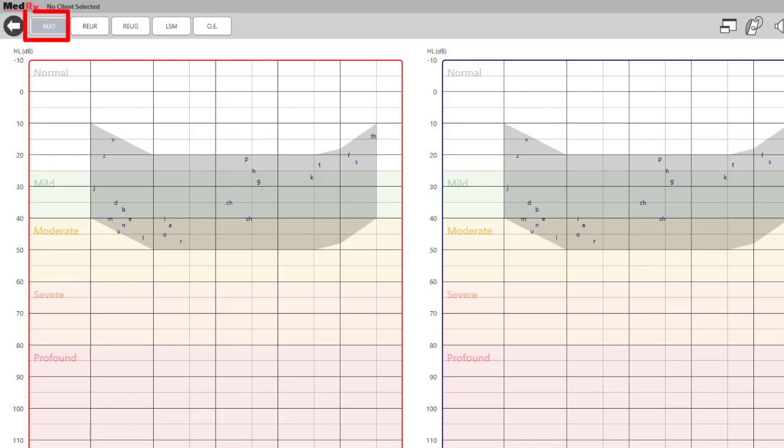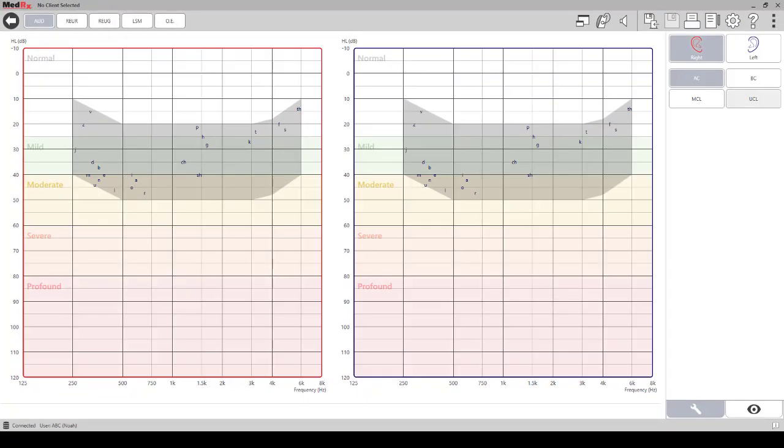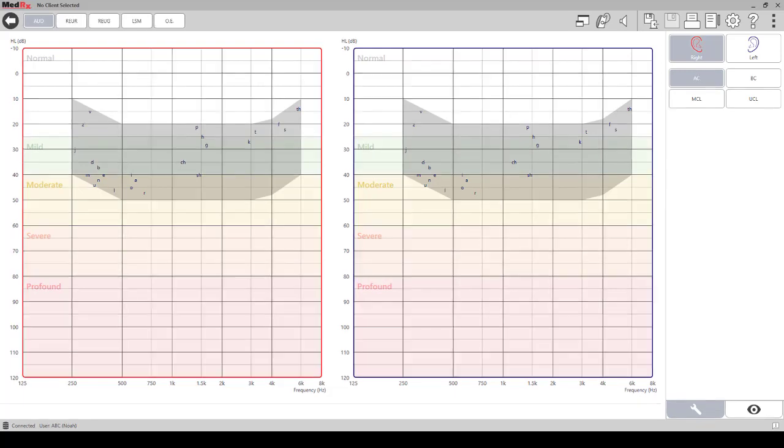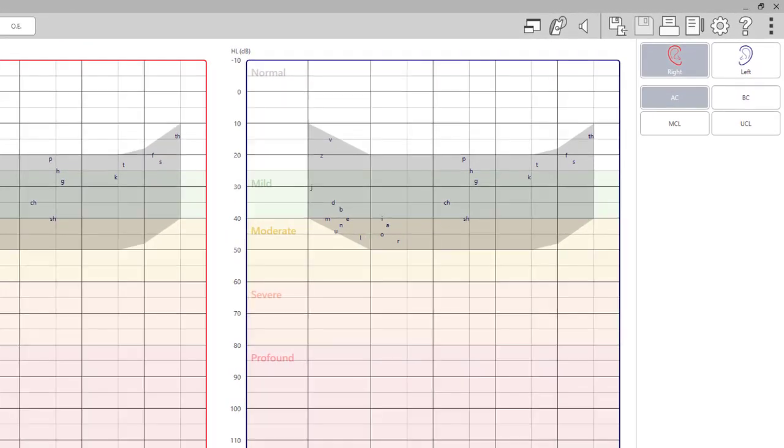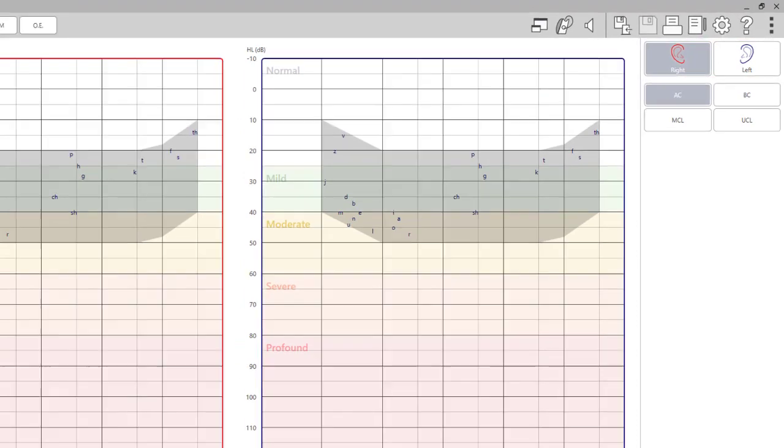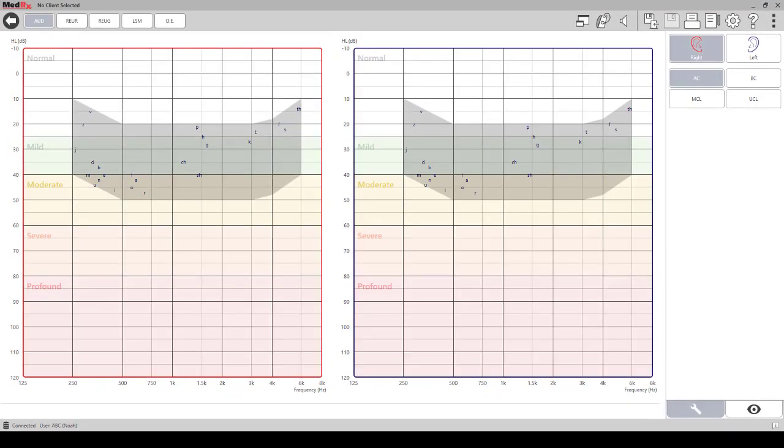The odd icon will allow you to enter or edit an audiogram and UCL data if you do not have NOAH or if you did not open studio through NOAH. You can also use this screen as a counseling screen to review hearing levels prior to performing measurements. This screen will display the audio in HL. Select the correct ear and test that you would like to enter. Enter or edit data as needed. New data entered here will save at the end of the session if you answer yes to save when prompted.